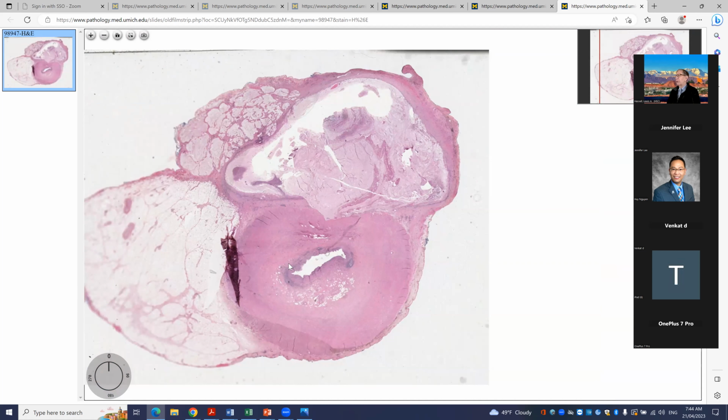And so doing complete sections, thoroughly looking to make sure you don't have some degree of epithelial proliferation or mucinous metaplastic type lesion in the appendix is appropriate. Now, as you know from looking at the staging on these lesions, if we have abnormal epithelium in here and mucin out here, that's considered to be a low-grade appendiceal mucinous neoplasm with transmural spread.